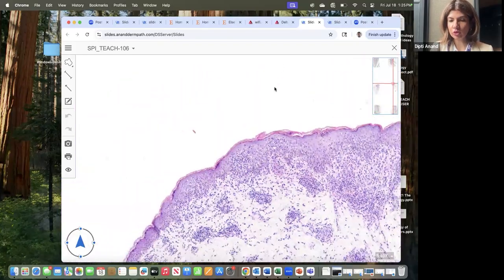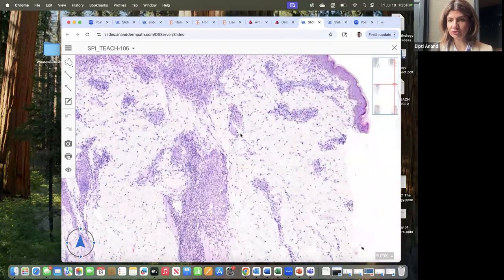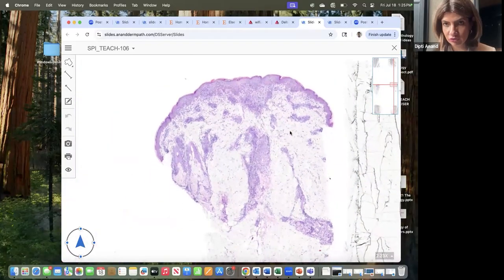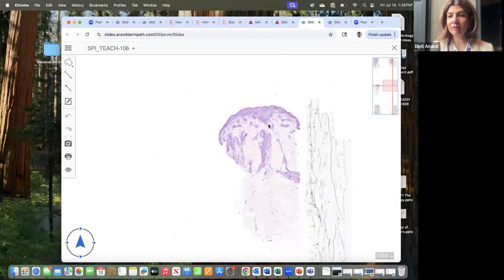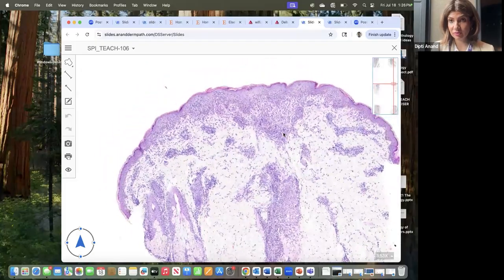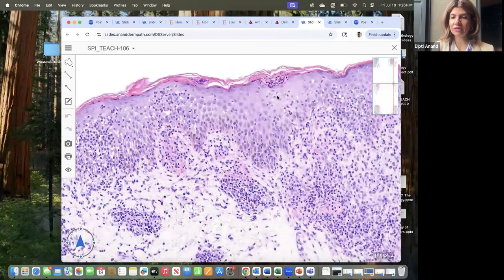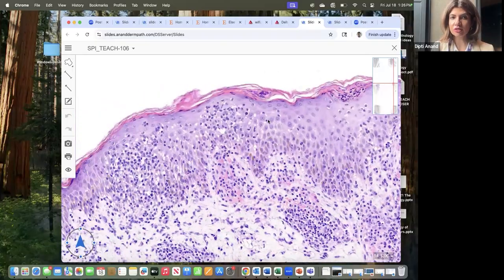And going from top to bottom, you have a wedge-shaped lymphocytic infiltrate. So that's the other way of approaching it. You have a superficial and deep lymphocytic infiltrate, right? But in PLEVA, remember, if you go up on high power, you will not see any eosinophils, right? And you're substantiating it because from top to bottom, you get everything. You get the parakeratosis. Very important is this point.